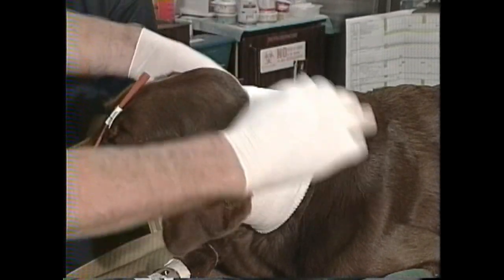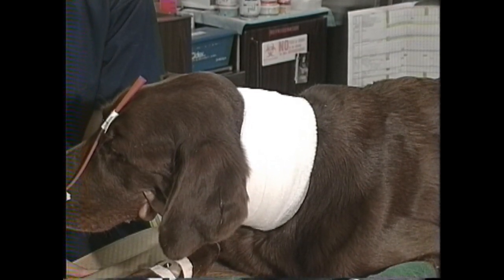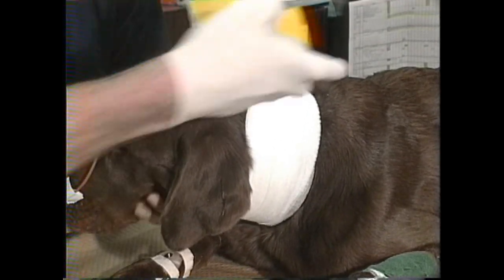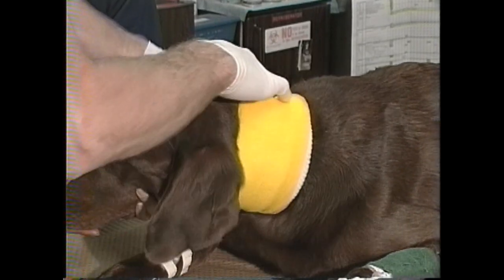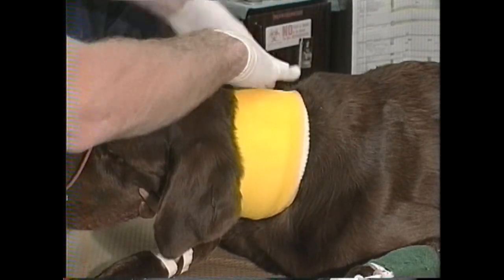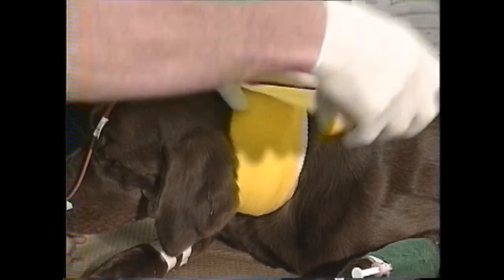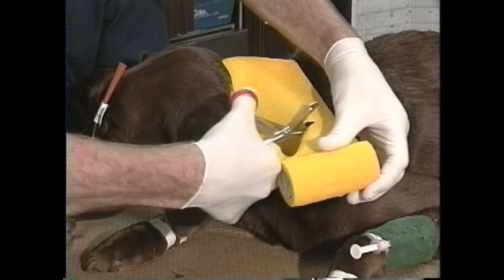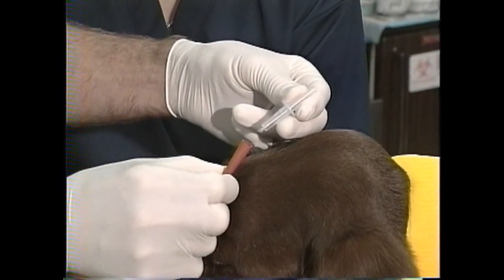We should put just enough cast padding and other material here to create a bulky bandage that'll be comfortable for the dog and serves as a good anchor for the tubing. Notice that the dog's nose should be pointing down more than this while I'm placing it — that way when the dog is not being restrained and wants to be in a natural position laying down, this bandage won't bind and be too tight. If I were to do this again I'd be more aggressive about pushing the dog's nose down.